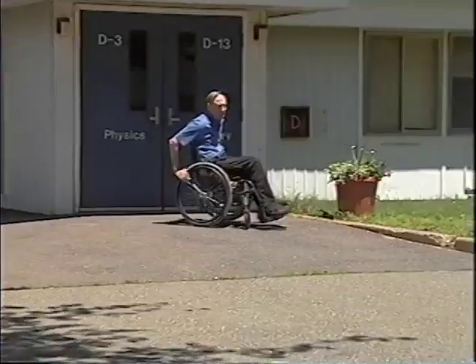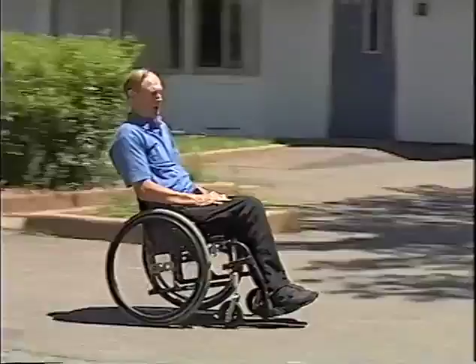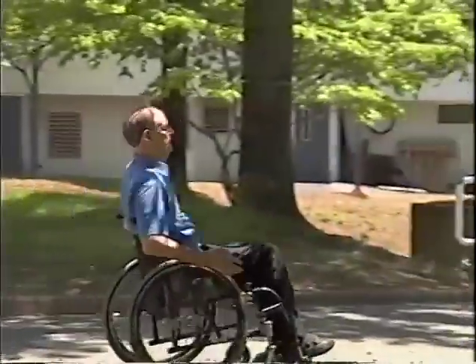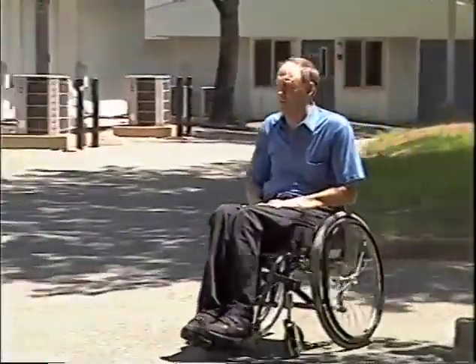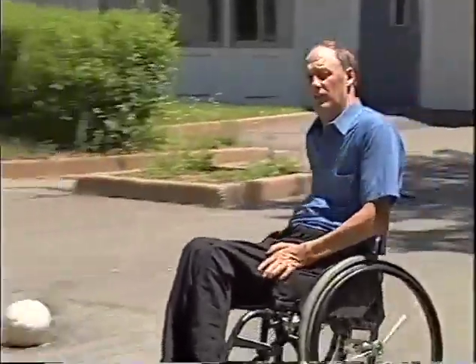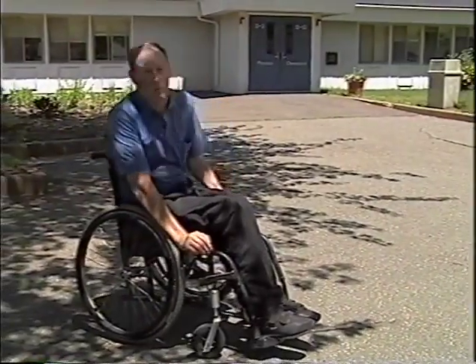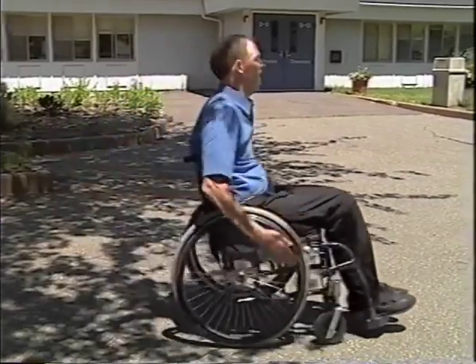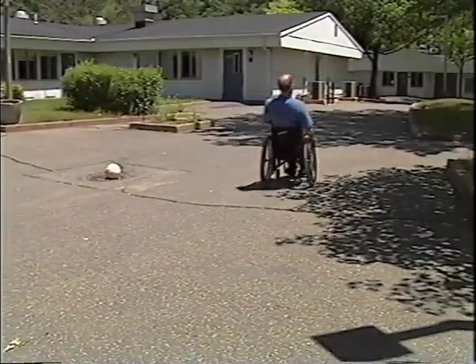And you're making it up the hill. With even more speed, it's even better. And if you're coming across this way, just let the hill pull you along and only wheel with one arm. But try to keep yourself moving. The faster you're moving, the less effect the slanted sidewalk will have on your wheelchair. And keep your weight back. If you want to go straight on a slanted sidewalk like this, lean way back, and the chair will basically go straight.